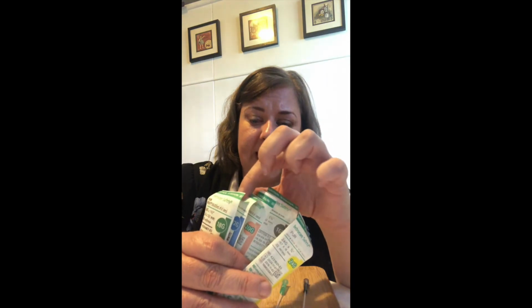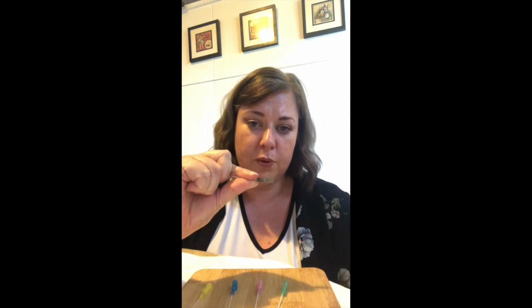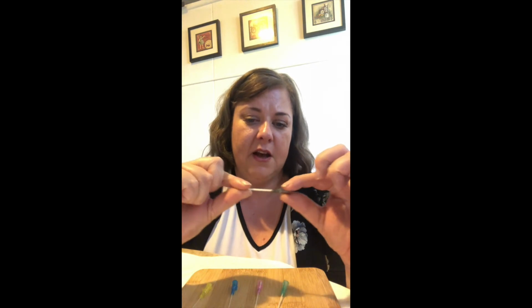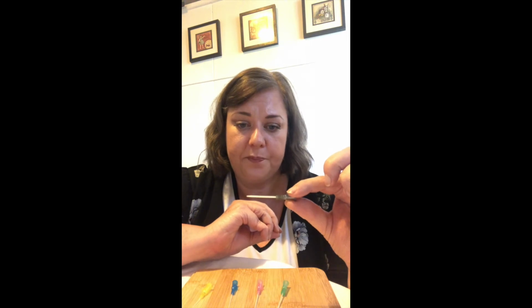When you first come across cannulas, you'll find them in their packaging. You can see they're quite clearly packaged and labelled according to their gauge and their colour, which makes it easy to identify, particularly when you're in a hurry. Now, this next portion is helpful for you to see the actual size of the cannulas, because once we insert the cannulas, we only see the coloured portion coming out of the patient, not the cannula that's actually inside the patient's vein.